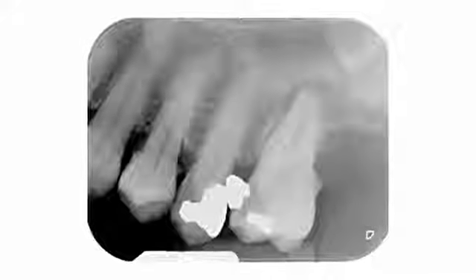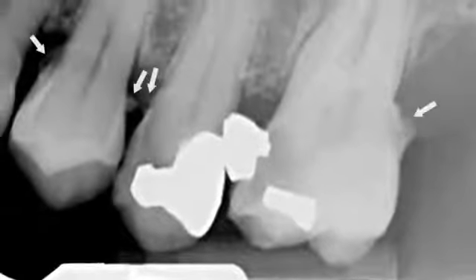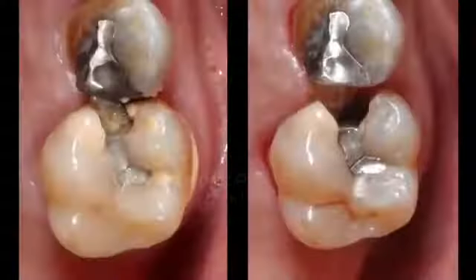Maxillary left first molar. A periapical radiograph showed that a mesial amalgam was fractured and displaced, with a large recurrent caries penetrating the pulp. The pulp chamber was occupied by extensive pulp stones. Abundant periodontal calculus could be discerned, and a periapical radiolucency was present. The pulp did not respond to sensibility tests.